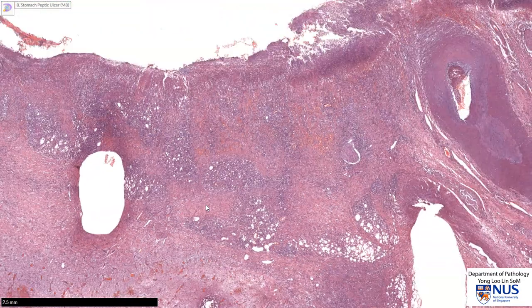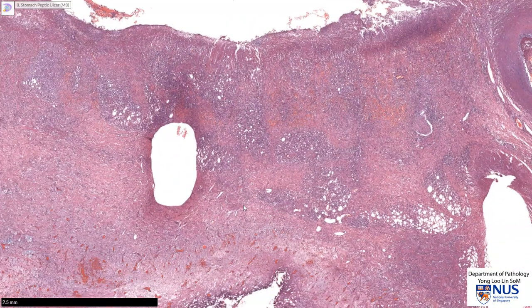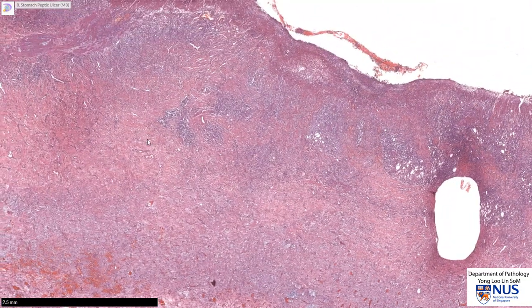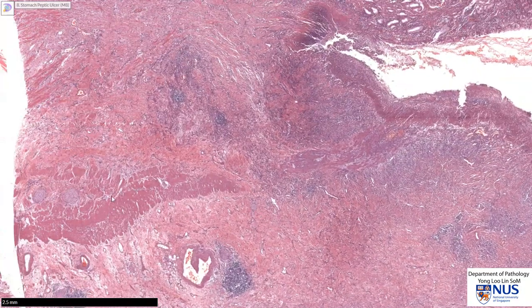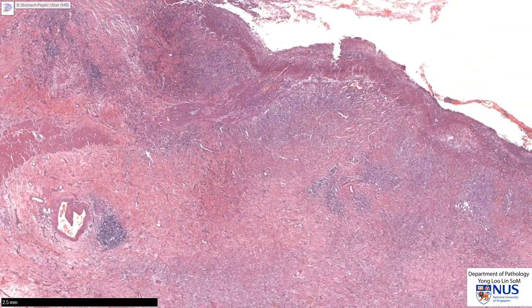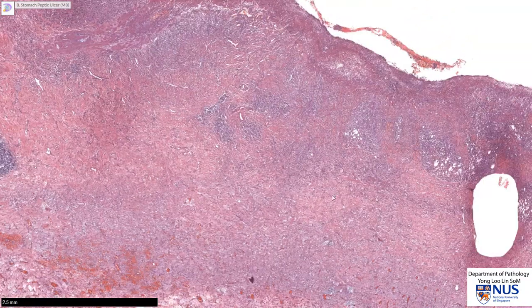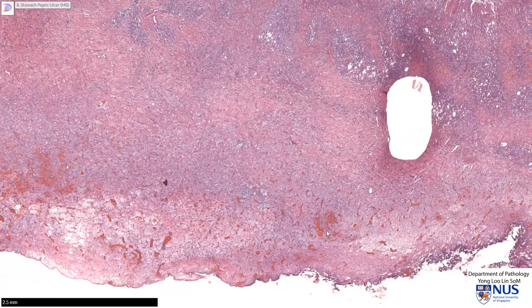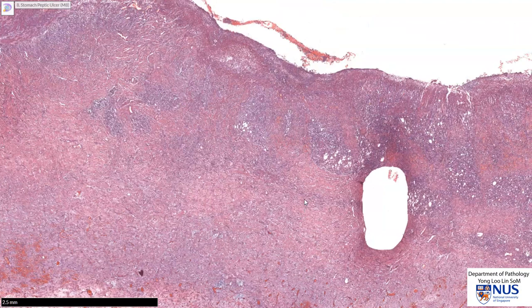So depending on how deep the ulcer is, it may heal with scarring. This particular ulcer is actually quite deep. Let me show you the level of the original muscularis propria. You can see that this ulcer has gone even deeper than the muscularis propria. So if this were to go on untreated, it will potentially perforate, and perforation can give rise to peritonitis.